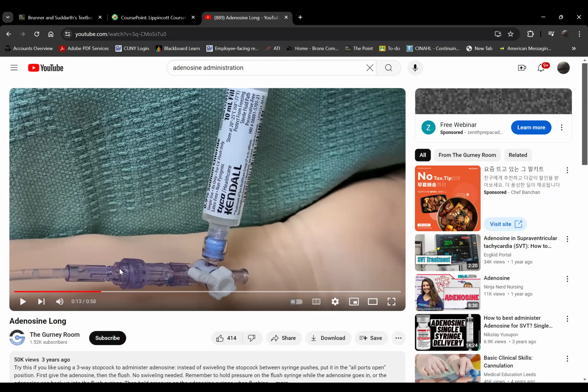Do you have time? Will you make it in 10 seconds? No, you'll waste time, right? By the time you give it, the drug is no longer effective. So you need a three-way stopcock. That way, you push the adenosine and then you push the flush right after it. That's the importance of this device right here, this attachment.